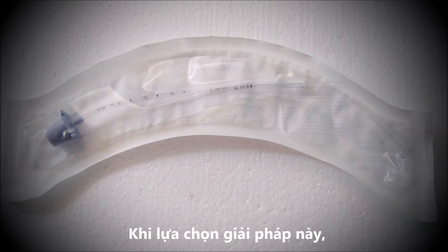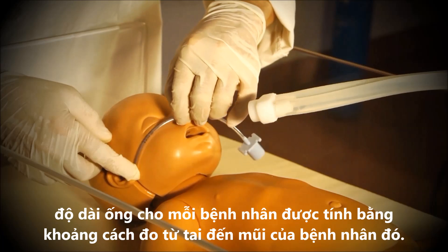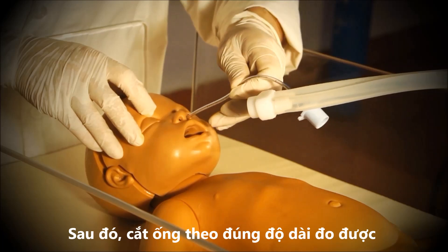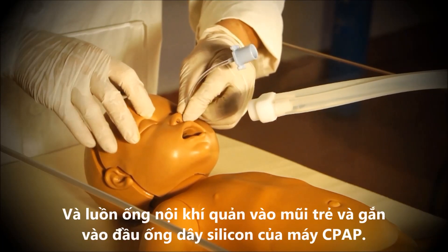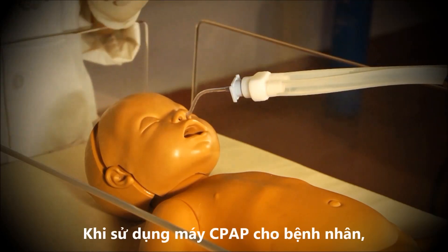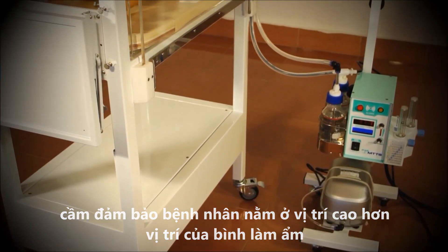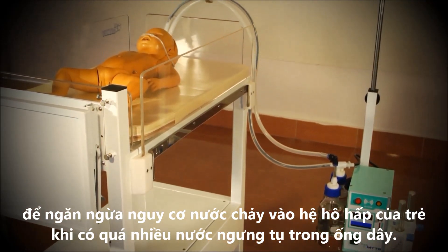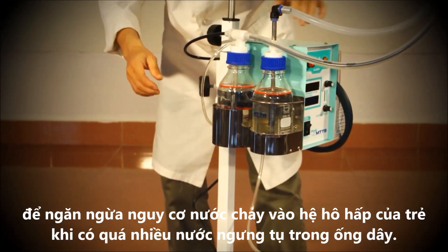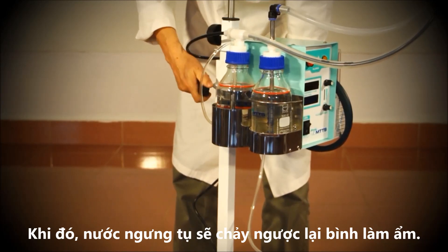To use this option, determine the appropriate length to cut the ET tube by measuring from the patient's ear to the patient's nose. Cut the ET tube accordingly. Then insert the ET tube and connect to the patient circuit. Once the patient is connected, make sure that the patient is positioned higher than the humidifier bottle to prevent the risk of water entering the patient's respiratory system in case of excessive condensation. In this case, any excess water would just drip back to the humidifier bottle.